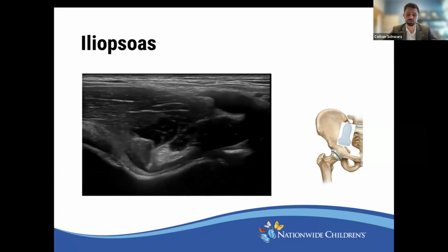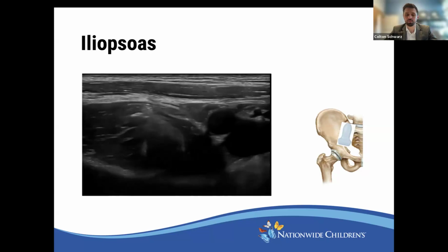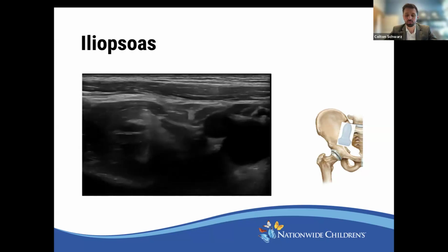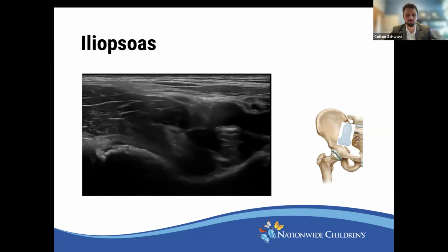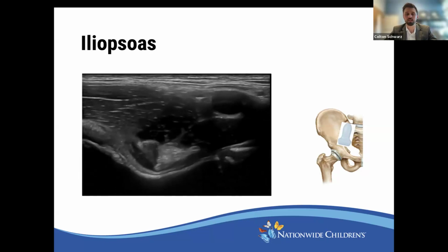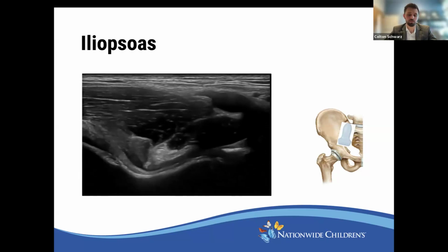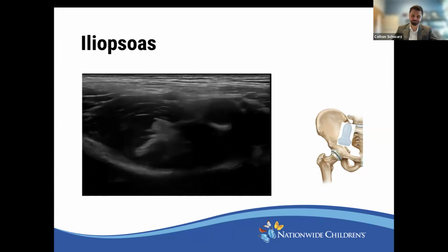With our patient, there's no abrupt snapping of the iliopsoas tendon as it moves medially and inferiorly back to the pelvic brim with leg extension and internal rotation. Although I will say he did have some pain along his ASIS when getting into that full FABER position.